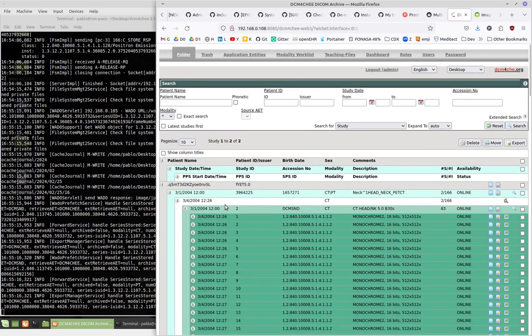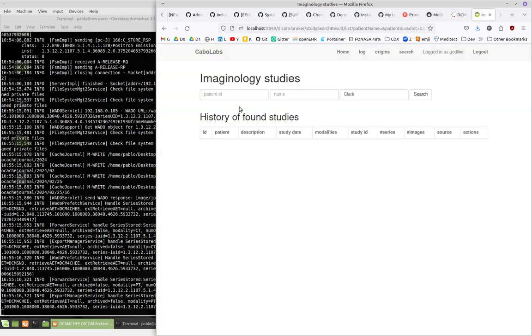So if I search for this anonymized, so let's search for this name.